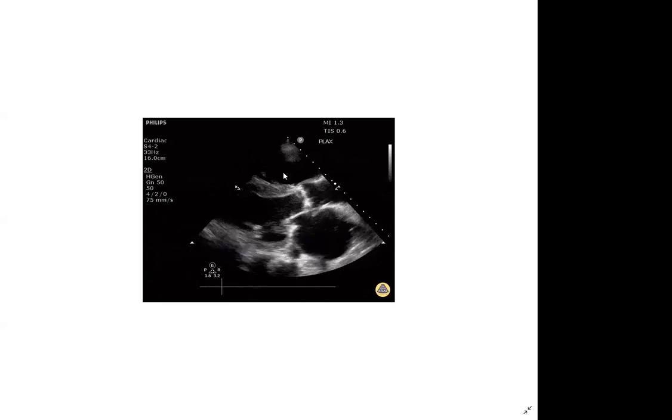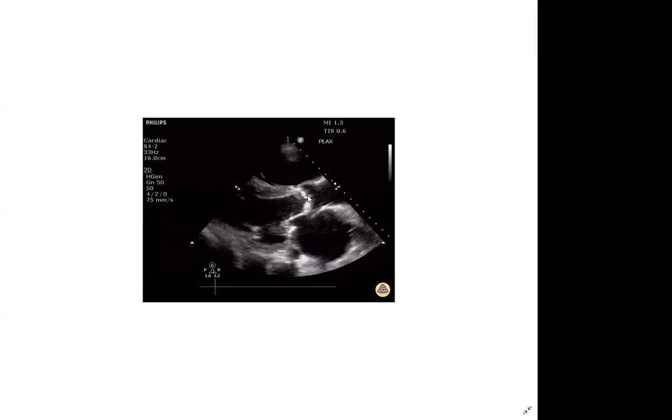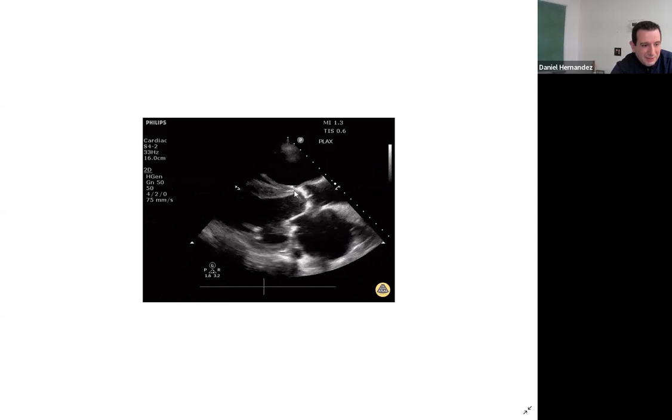I can't tell, is that calcification on the cord in the left ventricle? Those bright, yeah, there. Might just be the way we're clipping the cord. The cords typically don't get calcified. Okay, but this definitely looks calcified. It's echogenic. I'm not really getting that much shadowing, but it's very echogenic. And this looks like maybe some calcification here now. Compared to that other one, this definitely looks a lot brighter.